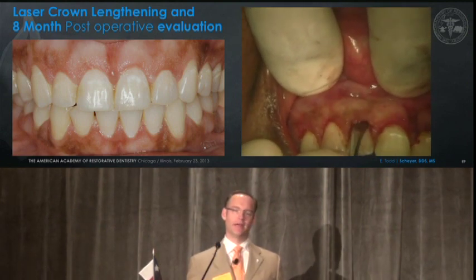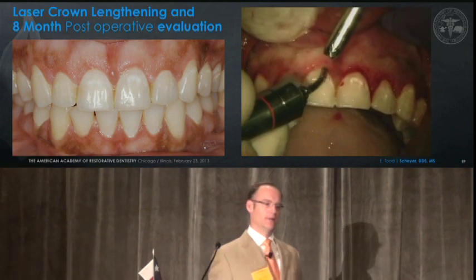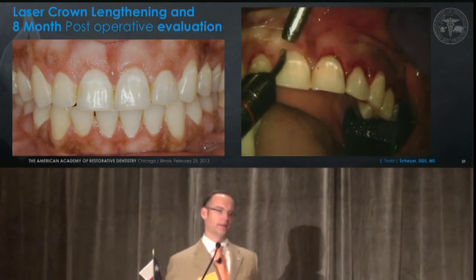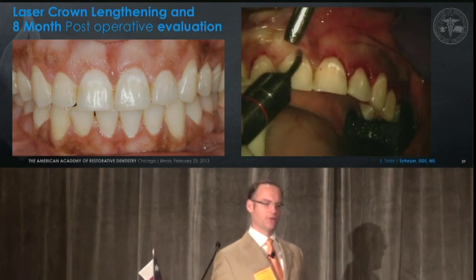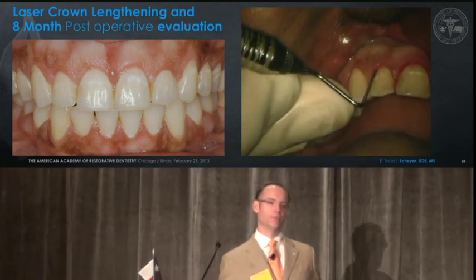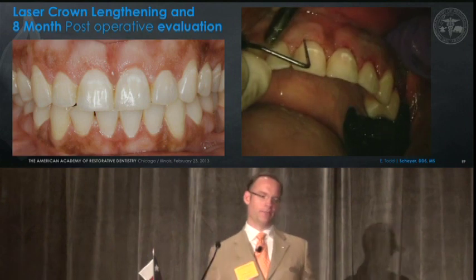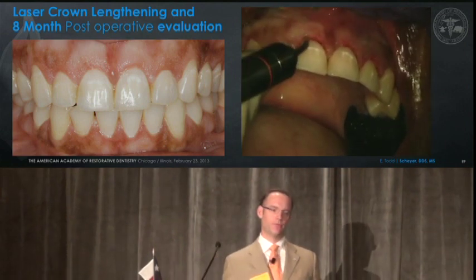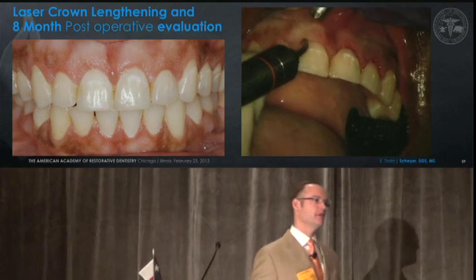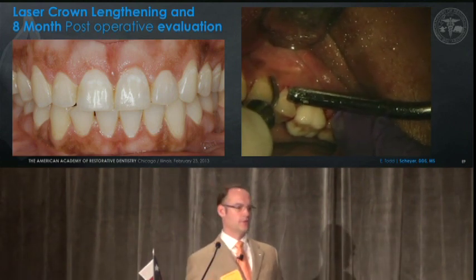Using a Glickman elevator for a peek-a-boo approach gives a little better access to the crestal bone. We've changed our laser settings to a bone-cutting wavelength, adding water dispersed from the laser tip for cooling. We're sounding the bone with our laser tip, then backing off half a millimeter to a millimeter and allowing the laser to ablate the hard tissues. We're getting almost four millimeters of bone sounding from the free gingival margin. This is a lengthy procedure — in this case the laser crown lengthening portion took 90 minutes, compared to flap osseous crown lengthening.